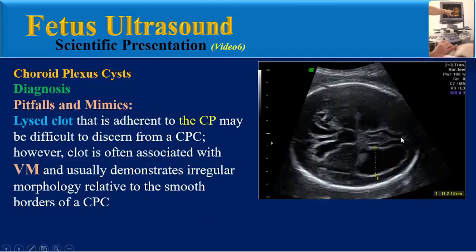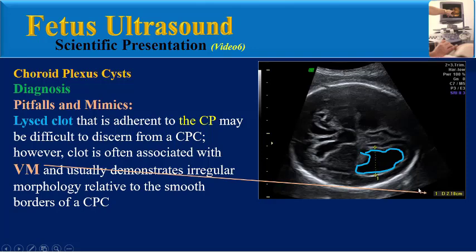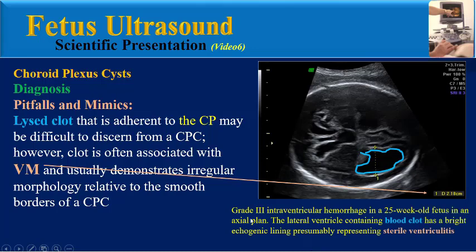Lysed clot adherent to choroid plexus may be difficult to differentiate from a choroid plexus cyst. However, clot is often associated with ventriculomegaly and usually demonstrates irregular morphology relative to the smooth borders of a choroid plexus cyst. This image shows a grade 3 intraventricular hemorrhage. The lateral ventricle containing blood clot has a bright echogenic lining, presumably representing sterile ventriculitis.